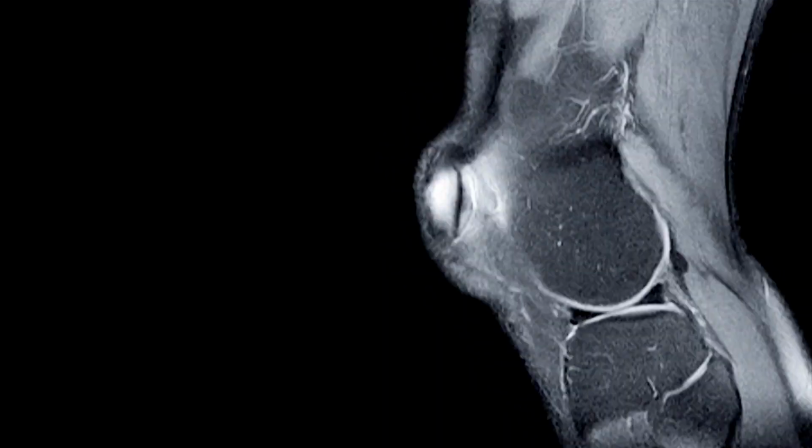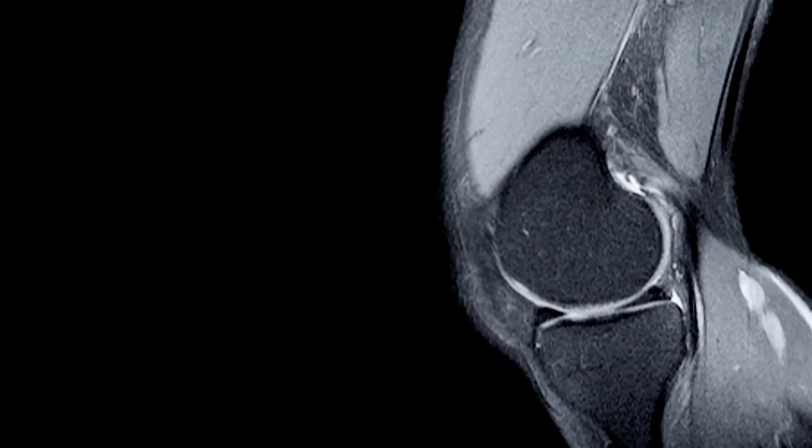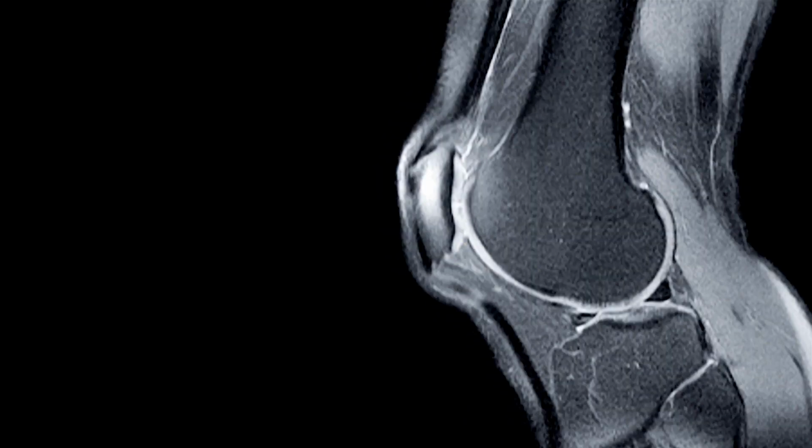Now, a few misconceptions about MRIs that we need to clear up. An MRI is not a picture inside of the knee. A lot of people think, hey, the MRI is gonna give us everything we need to know and it can never be wrong, and it's gonna see what's going on, we'll have all the answers. That's not true. An MRI is an excellent detailed view, but remember, it's just a representation of what's going on inside your knee. It's not a picture, it's not a photograph, and they can be wrong. Sometimes they show things are injured that aren't injured, sometimes they miss injury, so MRIs are not perfect.